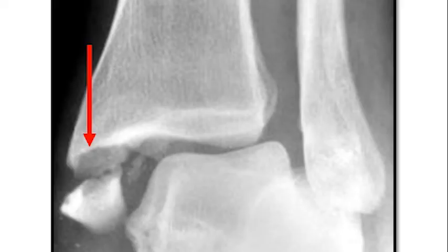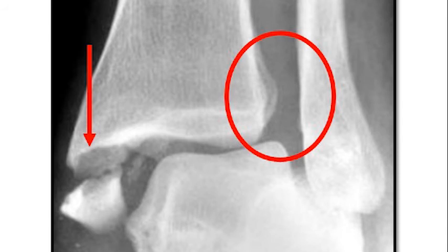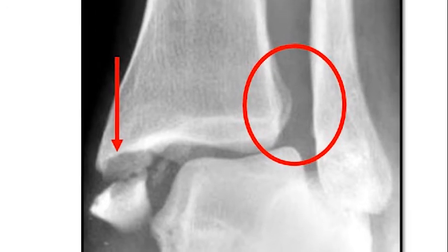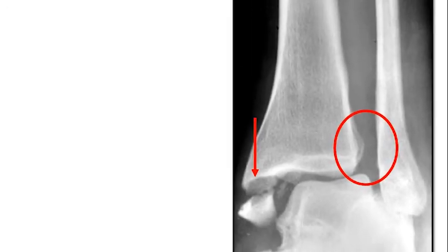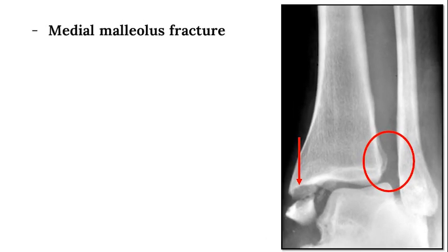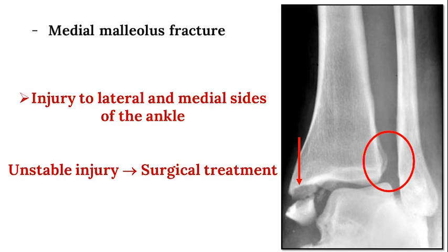On this radiograph, the medial malleolus is fractured, and there is a significant increase in tibiofibular clear space indicating a syndesmotic injury. Given that the syndesmosis on the lateral side of the ankle is injured in the setting of a fracture of the medial malleolus, this is an unstable injury that requires surgery.